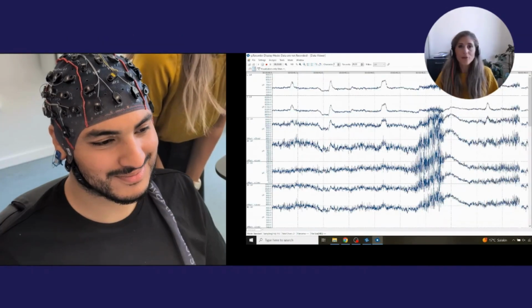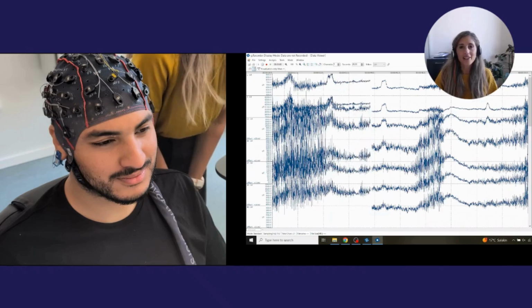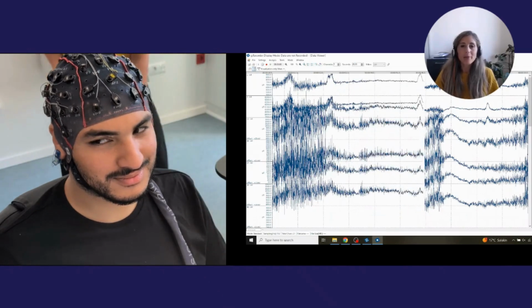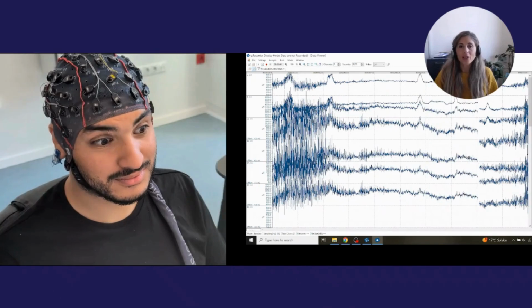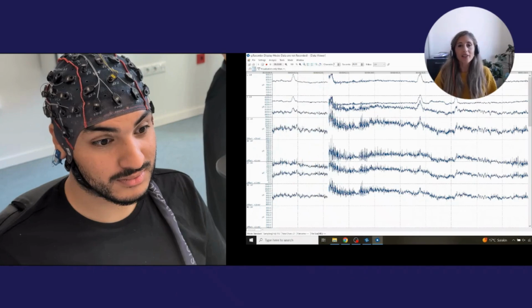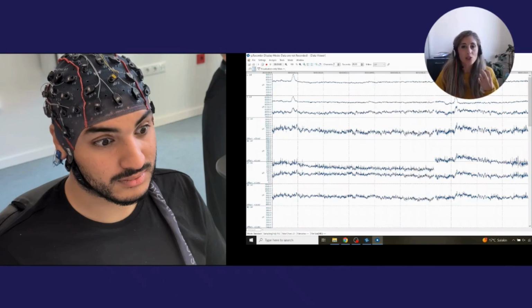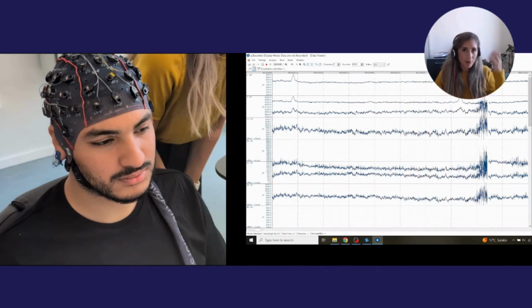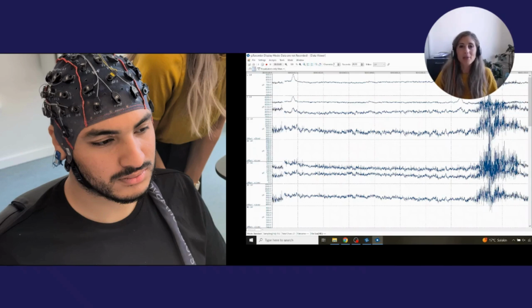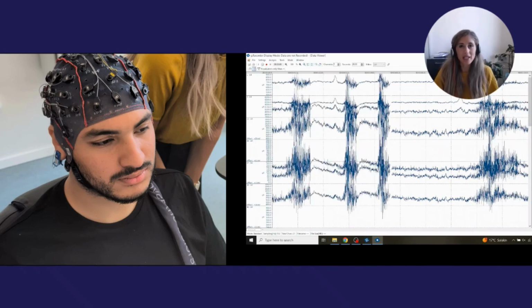Another type of artifact is created by EMG signals, which come from the tension of the muscles. This is visible as very fast spikes in the signals, and is usually created by the jaw, for example if the participant is chewing, or by muscles from the forehead. So if the participant is making some movement or some expression, or even if they are speaking.